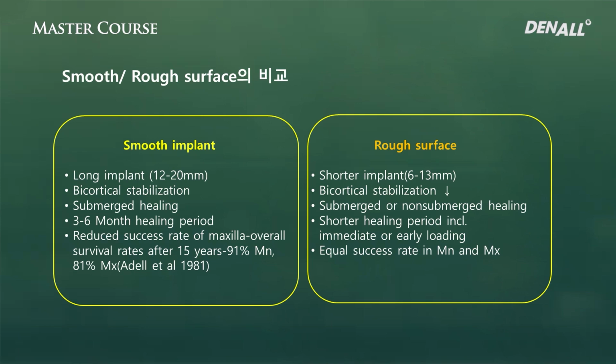Next is bicortical stabilization. In the past, we emphasized that cortical bone from both top and bottom should be engaged, but the emphasis on this has become much less these days with rough surface.